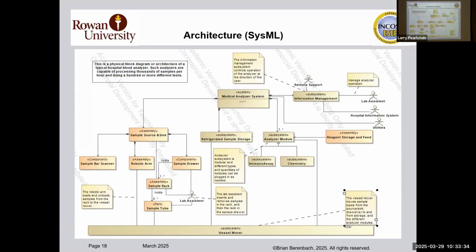Okay, so here is the architecture. And this is pure SysML. Here's the medical analyzer system, and we've tagged it as a system. Then we have sample source and sink during assembly, and we have refrigerated sample storage.